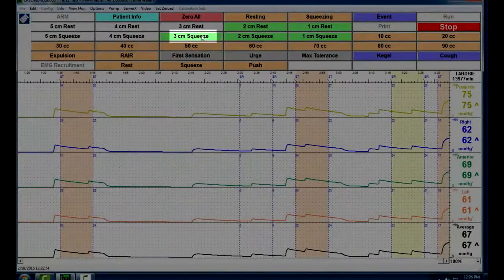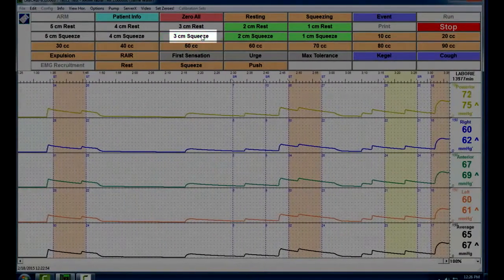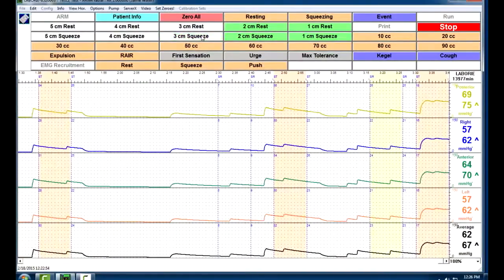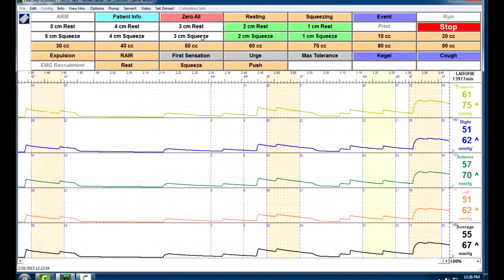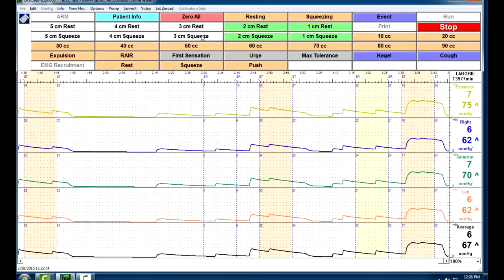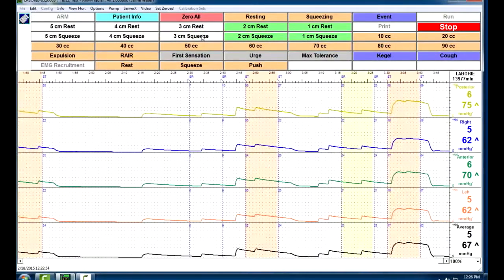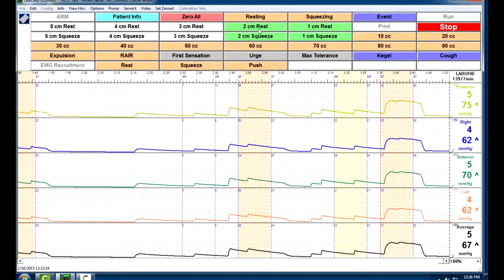Go ahead and squeeze. Give me a big tight squeeze. That's it. Keep going. Almost done. And relax. And then the patient can relax and quit squeezing, and again, we'll have them push a little bit to reset that pelvic floor.